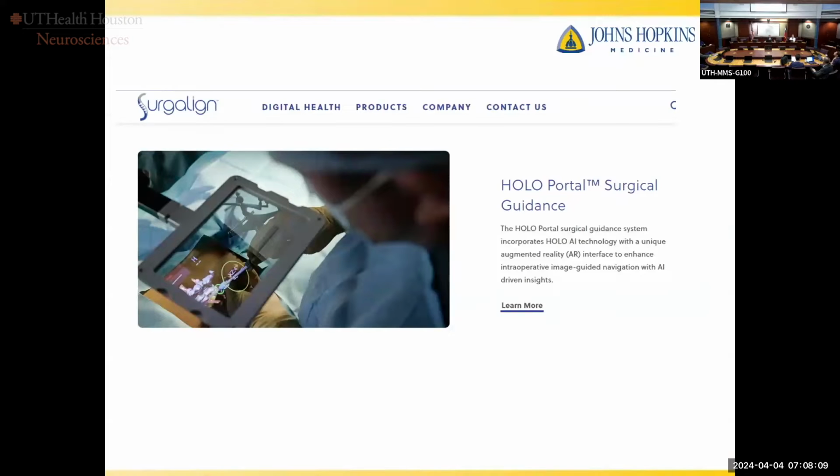This is an interesting device, and an example of a failed technology. I don't know if anybody was involved with Surgalign, but it seemed like kind of a strange idea to me, because you have this, it's almost like a little iPod thing that goes over the operative field while you're kind of trying to navigate underneath it. And the augmented views to assist with instrumentation placement show up on that iPod, but I never had a chance to try it out or use it, but it really didn't go over too well with the surgeons who did, and the company went belly up, basically.